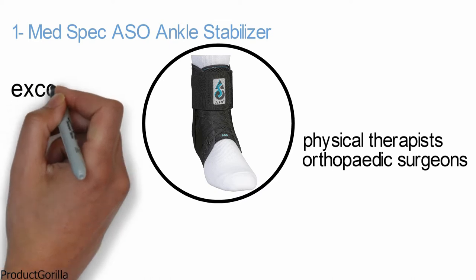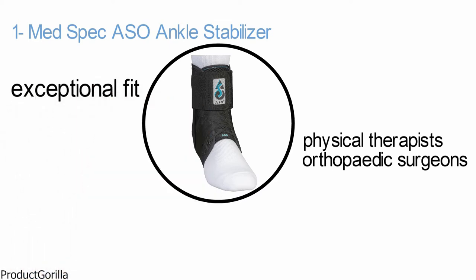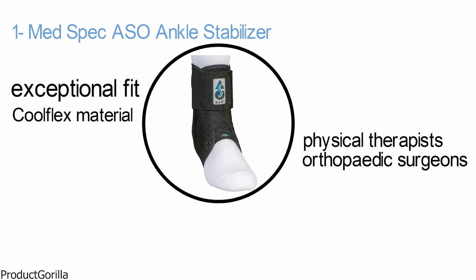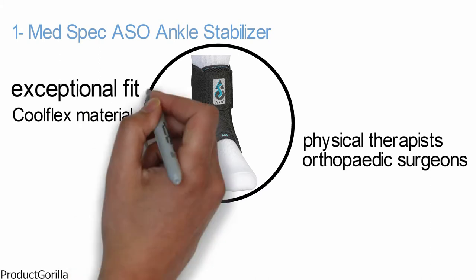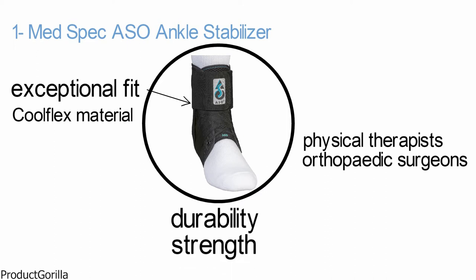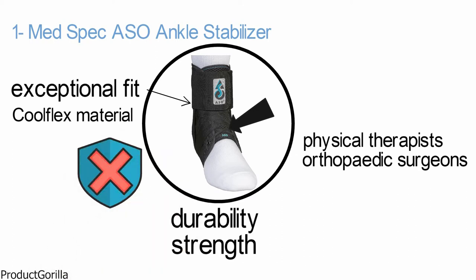The contoured tongue of this stabilizer provides an exceptional fit. It's constructed of lightweight yet durable cool flex material, which also lines the inside back of the boot to increase comfort and protection of the Achilles area. The ballistic nylon boot provides superior durability and strength with an invisible seam, which adds to superior comfort. The lace is attached to the tongue to keep it securely centered at all times.